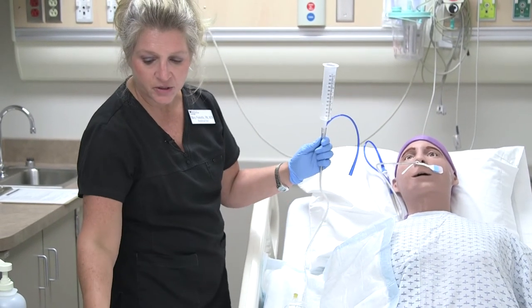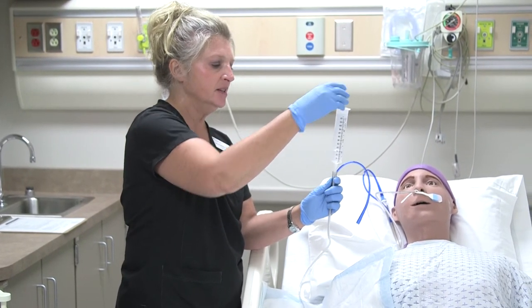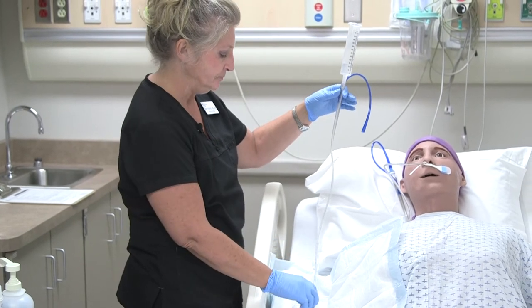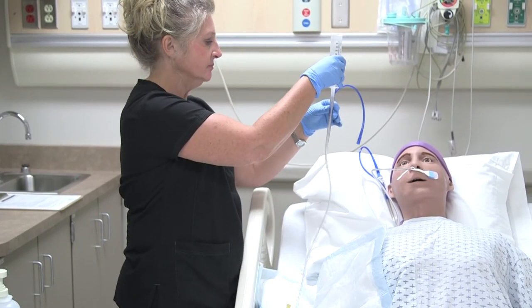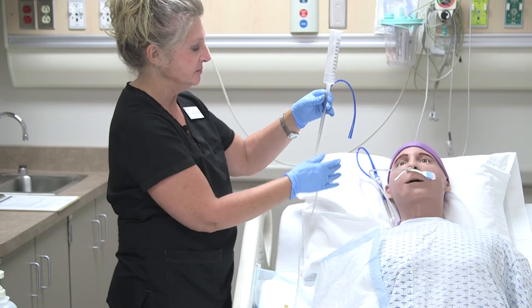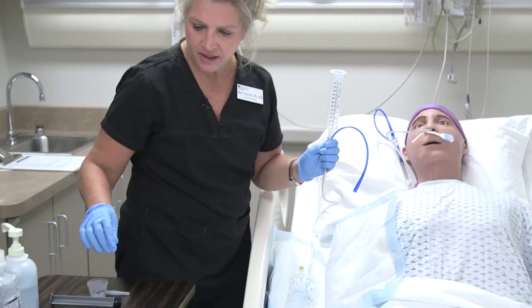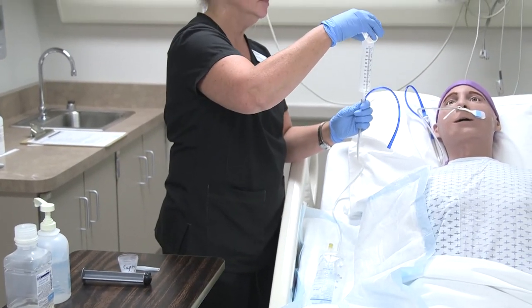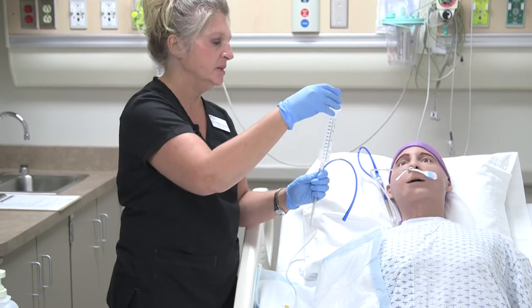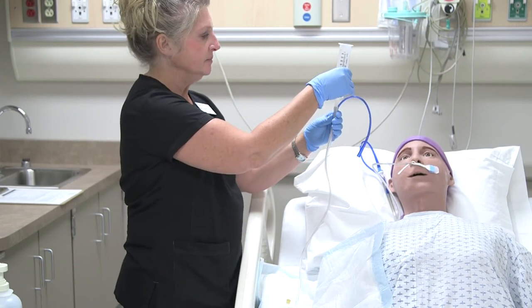Let that go in per gravity. We do have to flush after each medication is administered, so I'm going to flush in between with 15 mls. Always look at your policies. And then we have our Tylenol that we're giving. Sometimes it might settle, so just swish it around a little bit before you pour the rest of it in, so you get all your medication in. We'll let that go in.